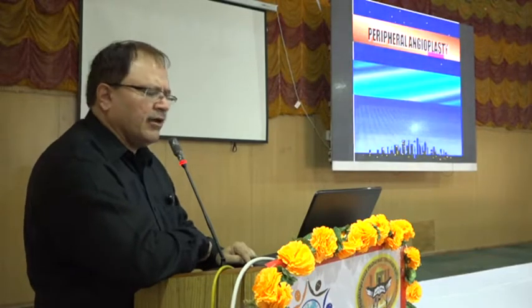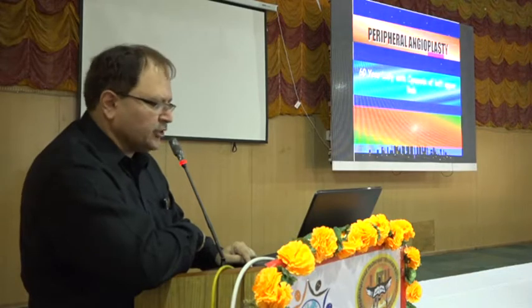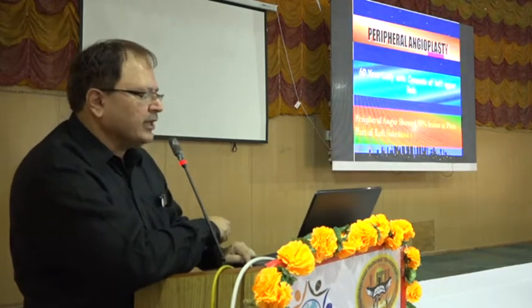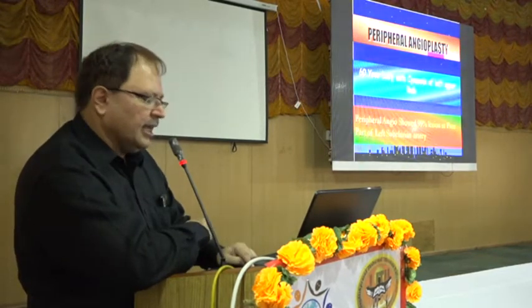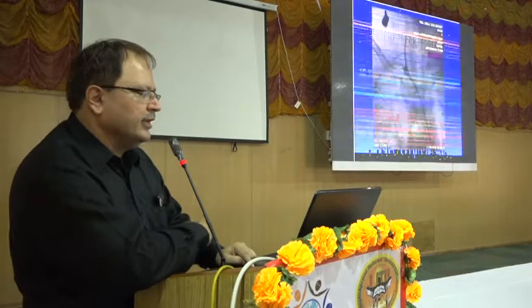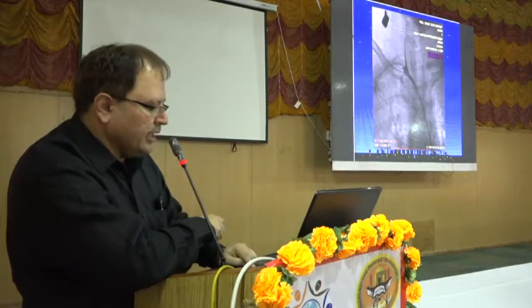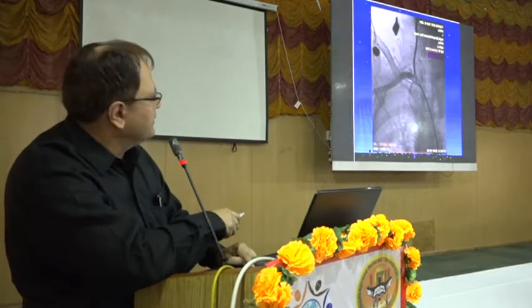Similarly, we are also doing a lot of peripheral angioplasties. We have got newer stents for peripheral angioplasty. Like a 60-year-old lady with symptoms in the left upper limb, peripheral angio showed a 99% lesion at the proximal part of the left subclavian artery, and her limb was symptomatic. So we did the angiogram, the left subclavian artery was almost 99 to 100% occluded, and we did the angioplasty. You can see the absolutely clear artery here, 100% clear.